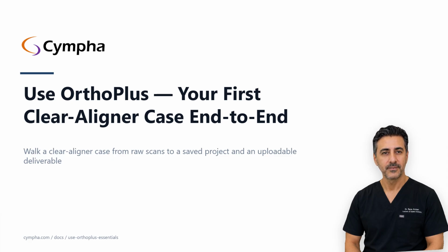Budget a generous first session. The first walkthrough is really about learning the pages. Cases go much faster once you know where everything lives. Follow along at your workstation, or listen now and read the written guide later.